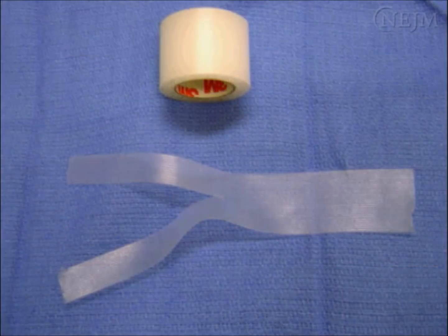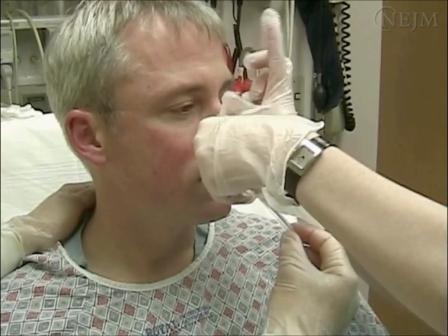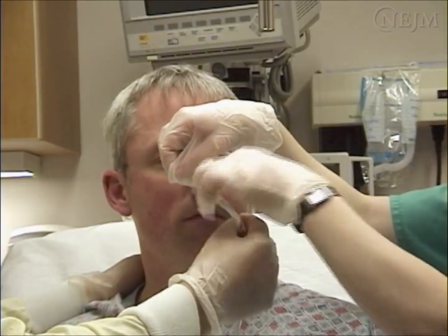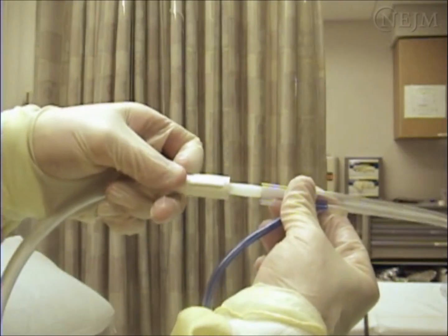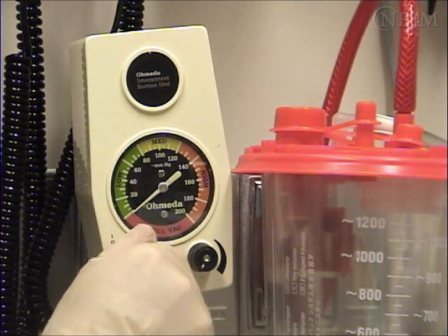Take a 5 to 7 centimeter strip of adhesive tape and tear it vertically for half of its length. The wide section is placed across the patient's nose, and the two tails are then wrapped in opposite directions around the NG tube. You may now connect the nasogastric tube to suction. Turn on the suction and adjust the vacuum force as desired.